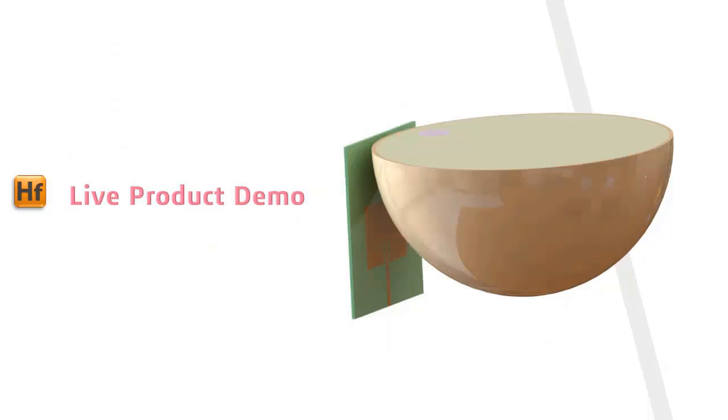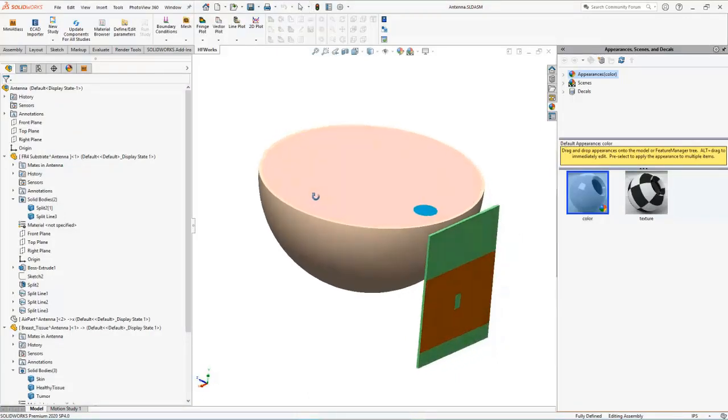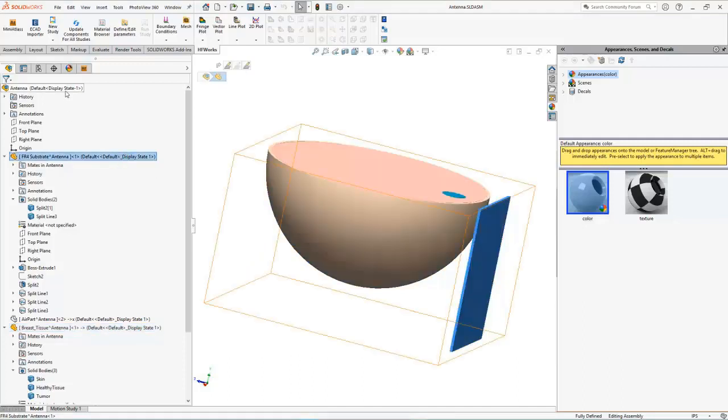And now, before moving to the designs and simulations, let's go through a quick exploration of the HFWorks interface inside SOLIDWORKS and check HFWorks main features. Here, you can see inside SOLIDWORKS I have built this model, where I have a model of a breast phantom and I have an antenna model. So this is an assembly inside SOLIDWORKS.